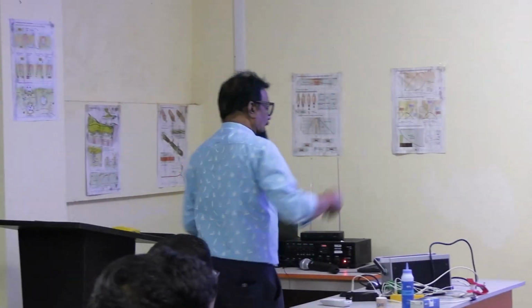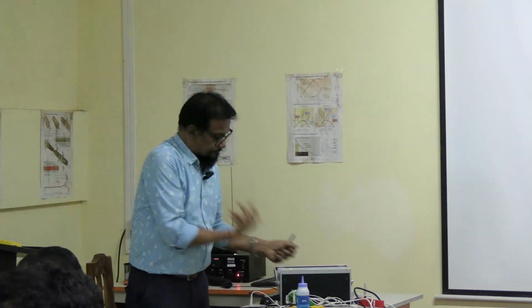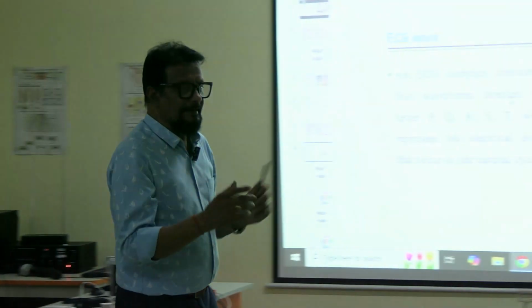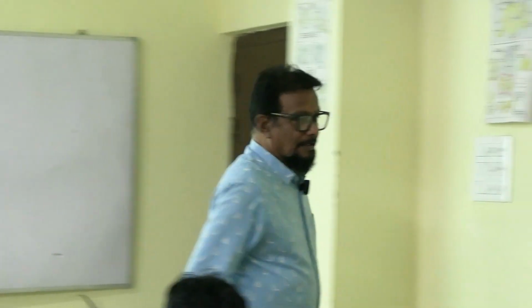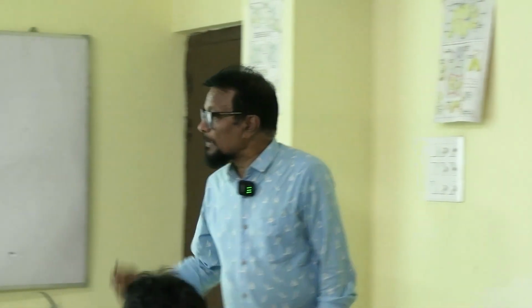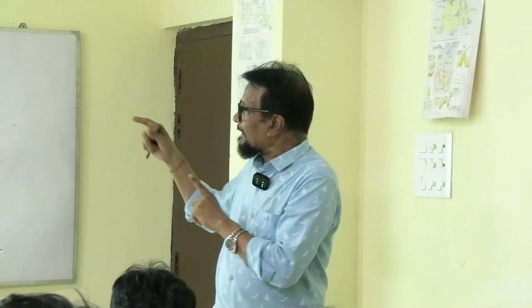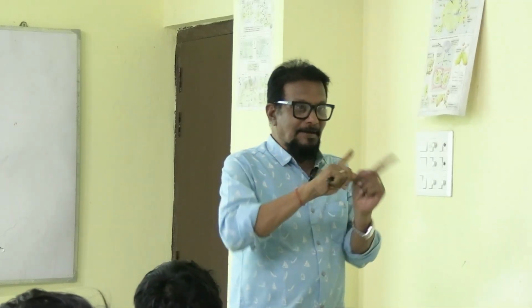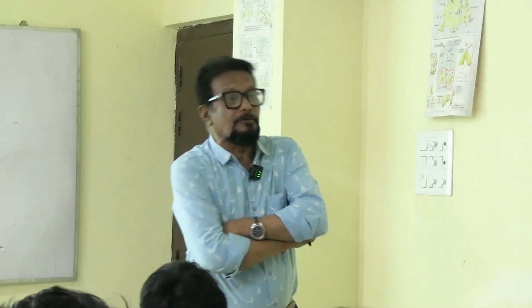It is another type, physically different. One looks like this radio, and the other is flat. We have that also. So this is the electrocardiograph. Here, the potential difference that we observed is amplified, and the amplified potential difference will be recorded during electrocardiography.